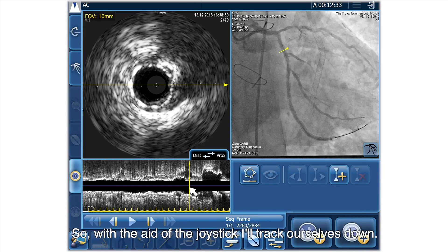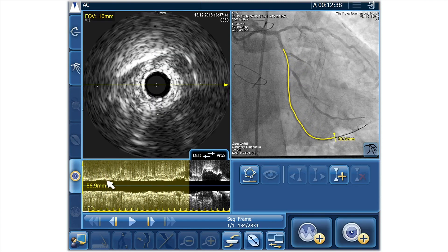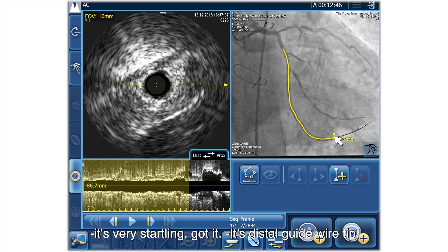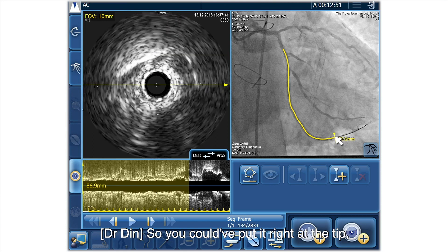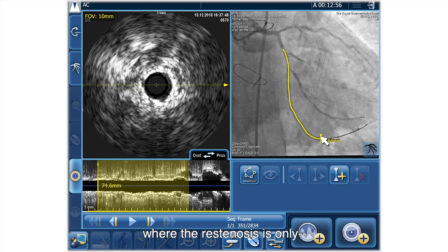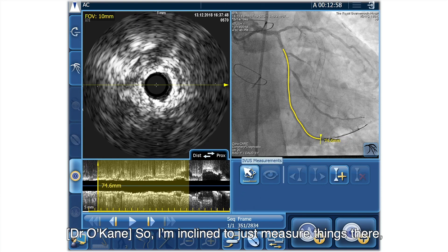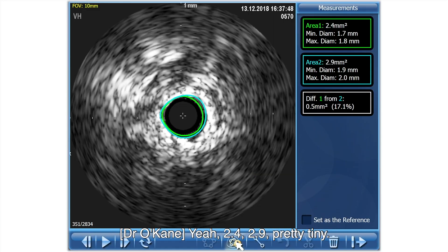With the aid of the joystick I'll track ourselves down. It's interesting - it hasn't quite got the very distal run. Where we'd put the X, it's the distal guide wire tip. It doesn't have to be the transition point - you could have put it right at the tip. I'd like to just measure things here; it's looking pretty small, 2.0 perhaps. 2.4, 2.9 - pretty tiny.